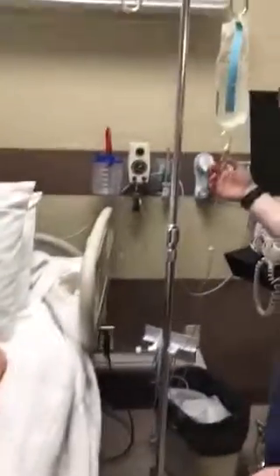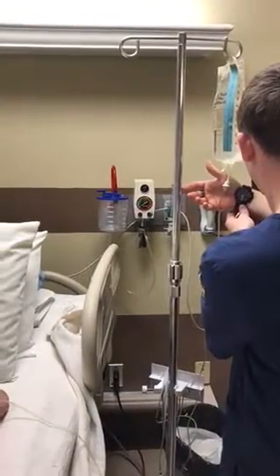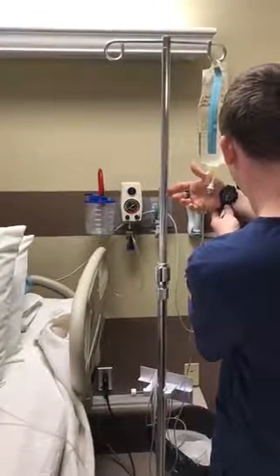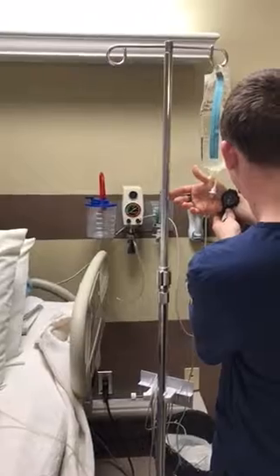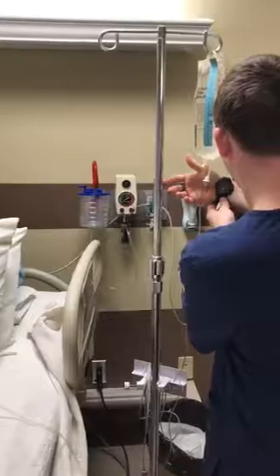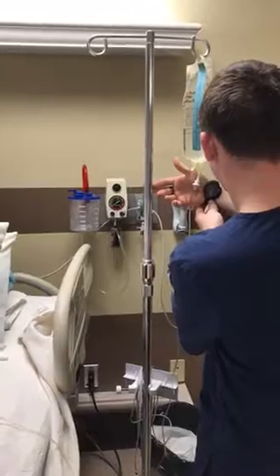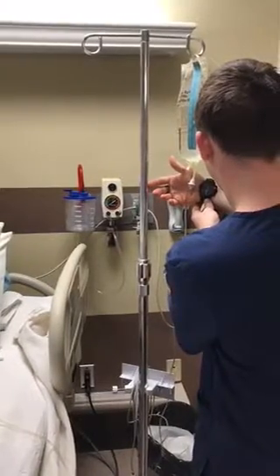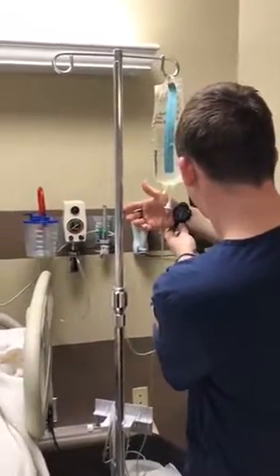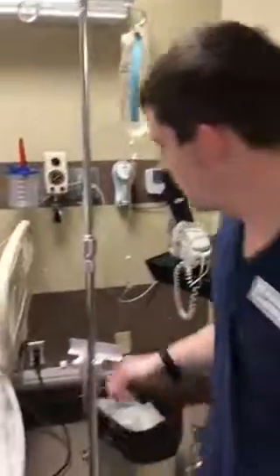And I'm going to make sure that our rate is still the same here. All right, so it looks like it's the right rate. We don't have to adjust it.